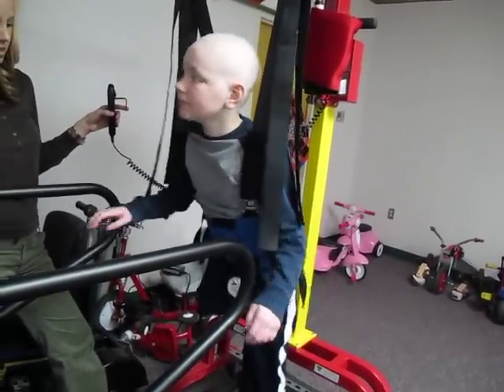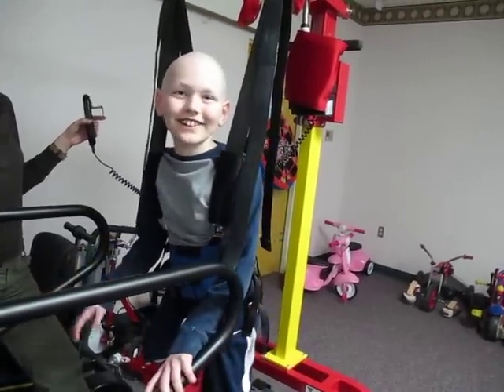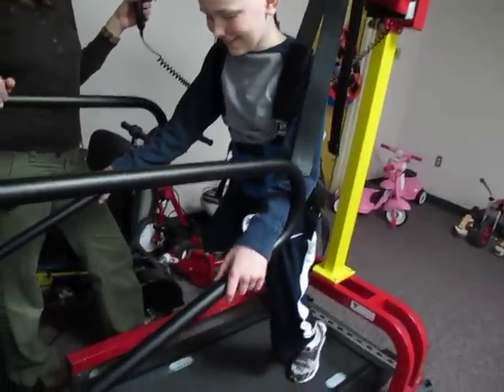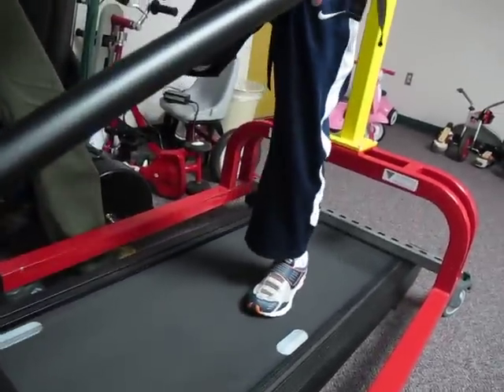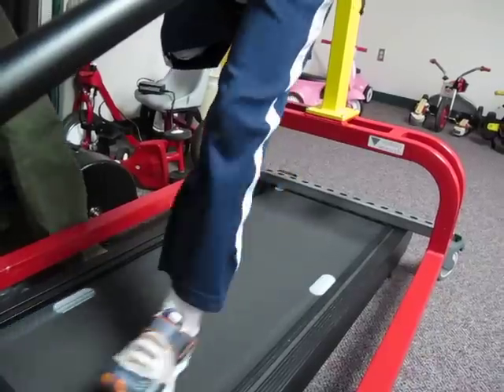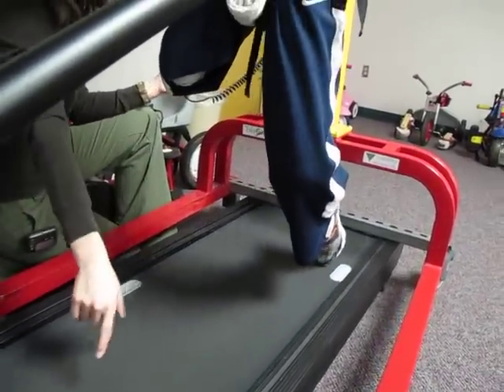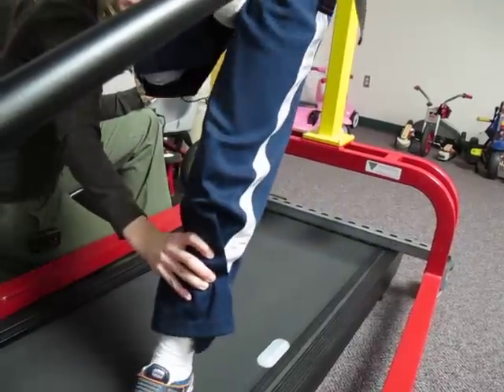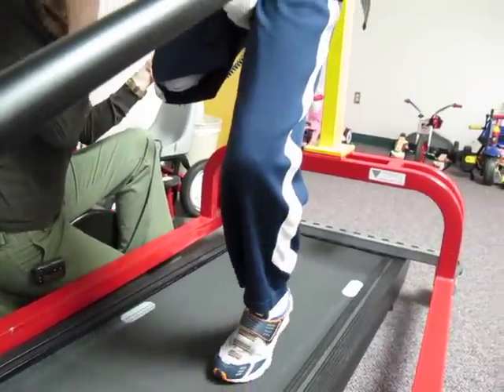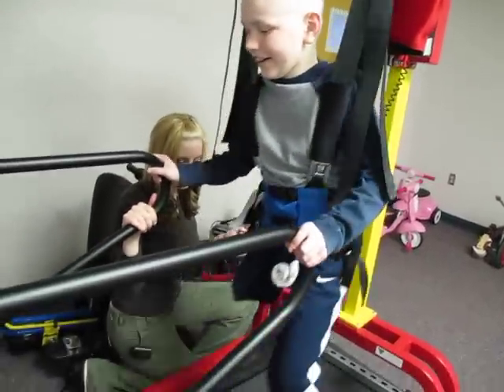We'll turn a movie on for you and just go. There you go. Big heel — and see how far back you can push with your knee extended. So land your heel. Now keep it all the way down. And then push.